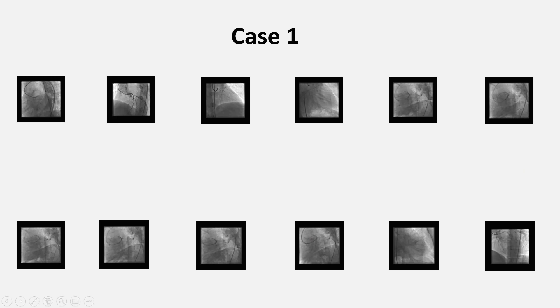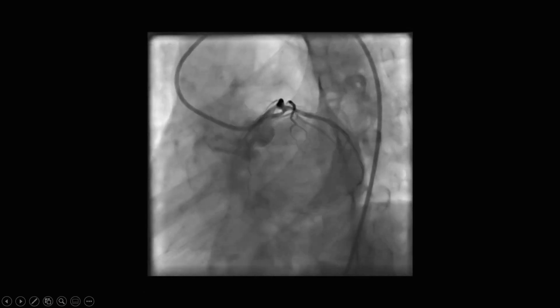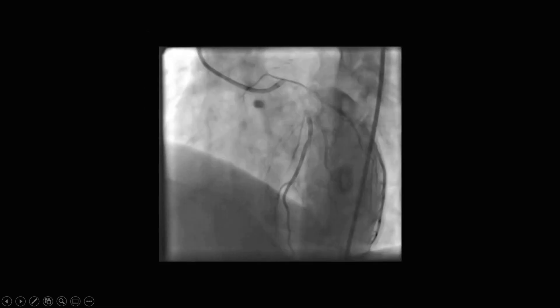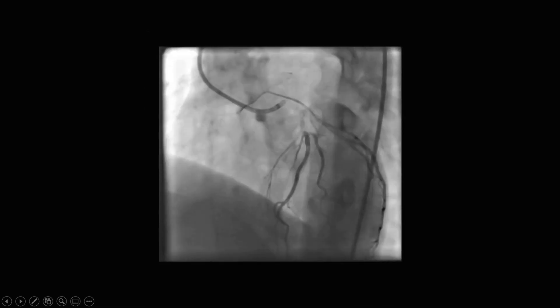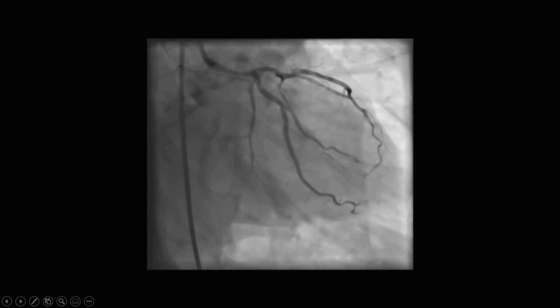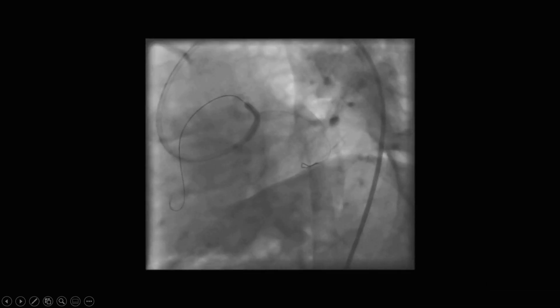Now let's look at our cases. The first one is a distal left main stem case. Here we see that the lesion extends into the proximal LAD, but the CX ostium appears intact. First, we wired both branches, and then we implanted a stent sized 1-to-1 according to the LAD. We made sure that the stent length allows for left main stem coverage of a segment longer than the shortest available balloon we have.